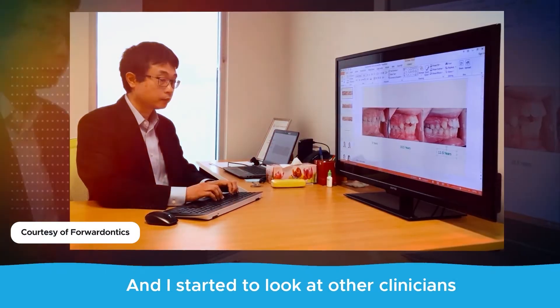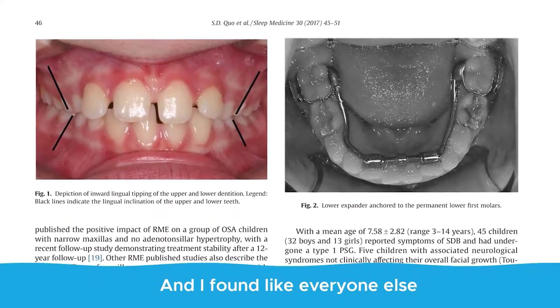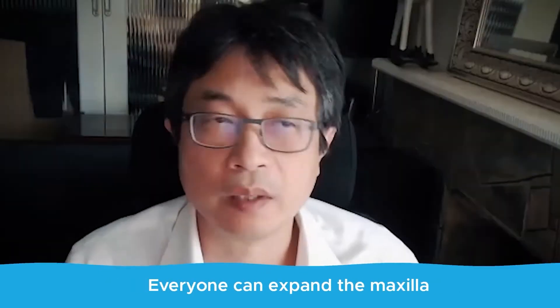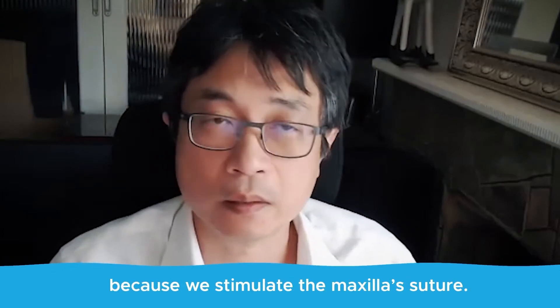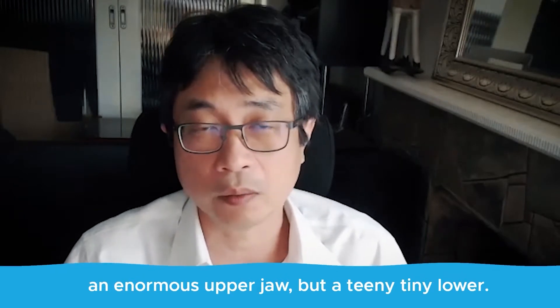I started to look at other clinicians who have been successful with lower expansion, and I found — like everyone else — that you can't expand the mandible. There's no suture to expand the mandible. Everyone can expand the maxilla because we stimulate the midpalatal suture, but we run into a situation where we've got an enormous upper jaw but a teeny tiny lower.